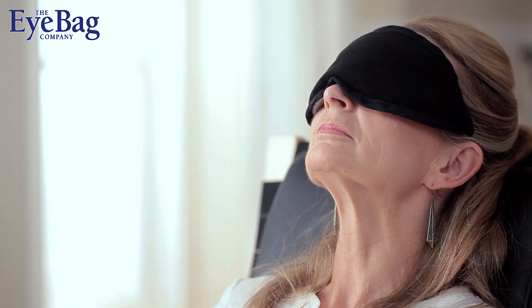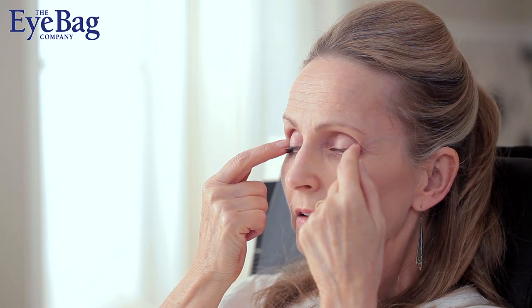Immediately after you remove the eye bag, massage your eyelids using an outward action. This sweeping massage can be repeated five to ten times over about 30 seconds. It may cause temporary blurring but you'll feel some relief from your symptoms immediately.